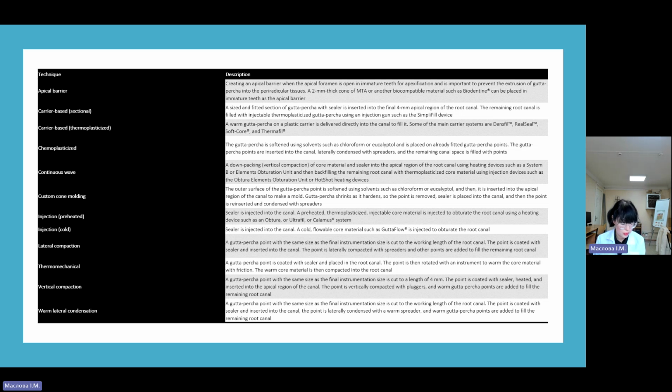Other constituents added to it for endodontic use include zinc oxide, 49.75%, waxes, coloring agents, antioxidants, and metal salts as radiopacifiers.